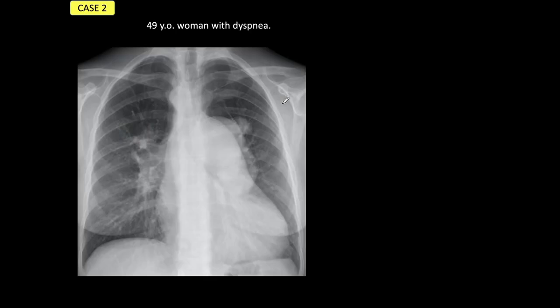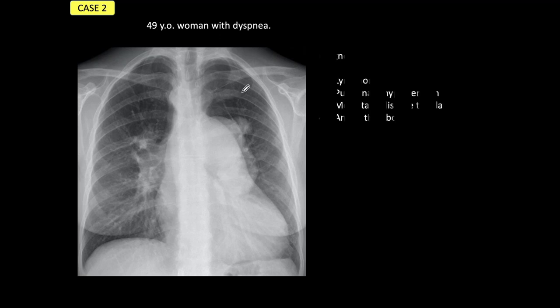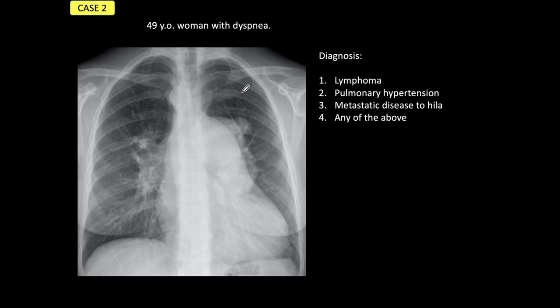Let's go to case number two. The PA radiograph belongs to a 49-year-old woman with dyspnea and is grossly abnormal. I'm giving you four possible diagnoses: the changes are due to lymphoma, pulmonary artery hypertension, metastatic disease to the hila, or any of the above.